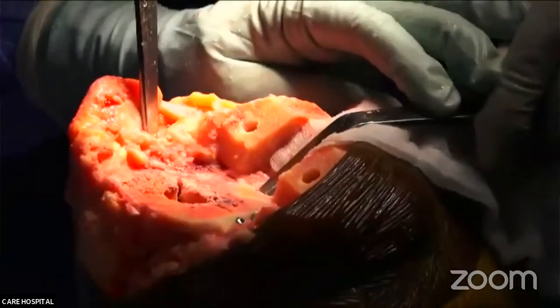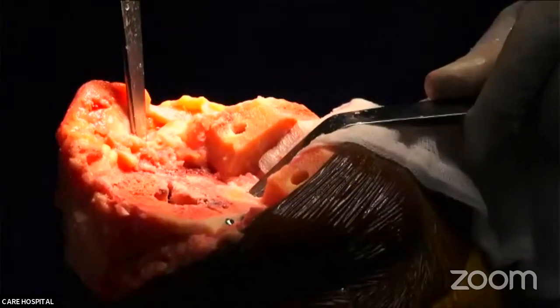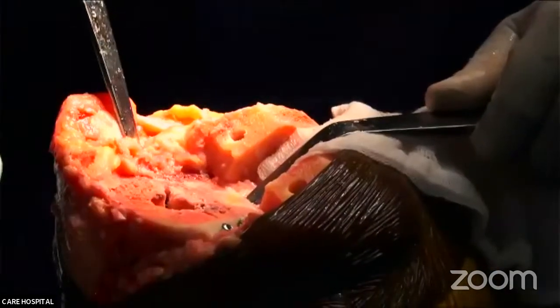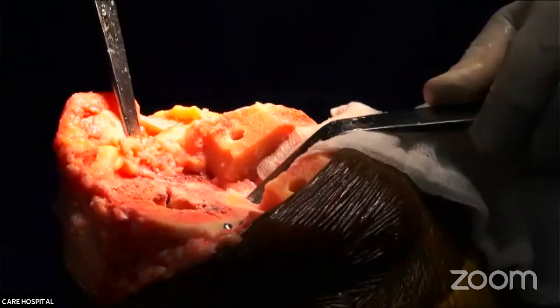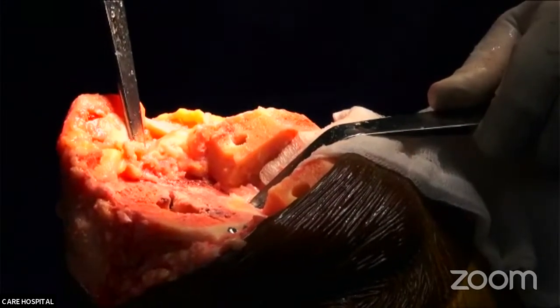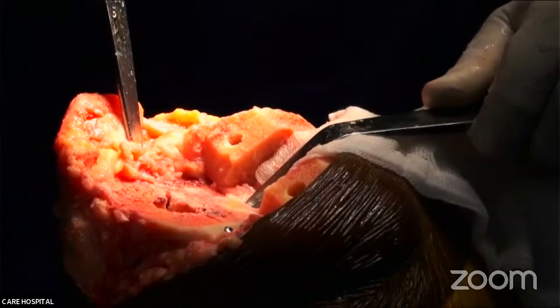Your trial and balancing was very good and represented nicely as decided pre-operatively, and planning was done accordingly. With so much deformity and defect, we can manage with a size 9 insert only, which is the smallest one. We can move the femoral component up or down, with conservative bone cuts with the robot.